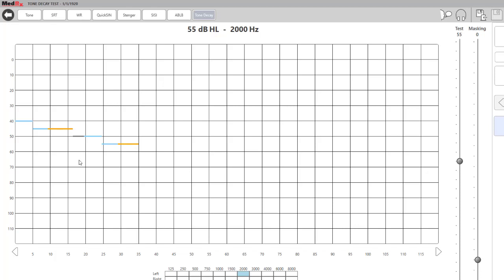In this case, the patient is continuing to hear the tone. Once the patient has heard the tone for 60 seconds, the line will stop, and the patient can release the button.